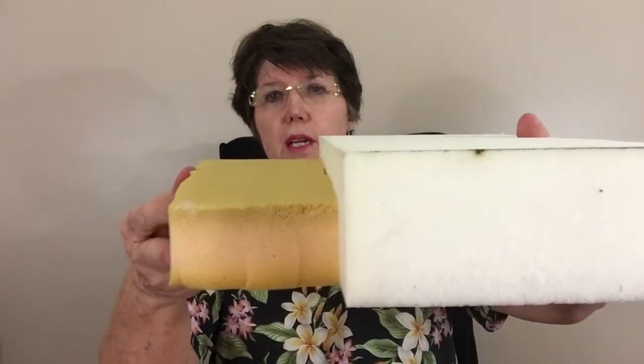Frequently you'll get something like that that will be two different heights. Or sometimes if you're suturing a back, the spine back together, the skin on the spine — depending on how the deeper layers have been approximated — will sometimes leave the incision at different heights. There might be other instances where you'd get an incision with different heights, so it took me a little bit of time to figure it out because your instincts are not correct in this. I have a little sample here — I'm going to put the bases together so you have an incision that's two different heights.